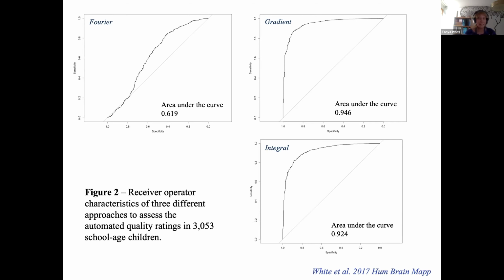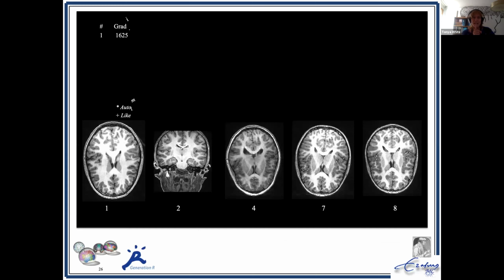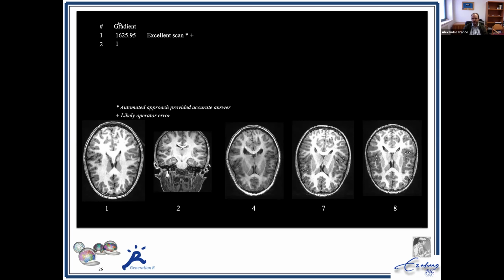Tonya, sorry, just a follow-up question there. You said that the operator redid the scan. Was there any specific criteria that the MRI tech used to repeat the scan, or was he just eyeballing the image and saw it was bad? It was eyeballing the image, because we had so many people and many of them were the radiology techs who were very difficult to train. Yes, I'm aware of that.